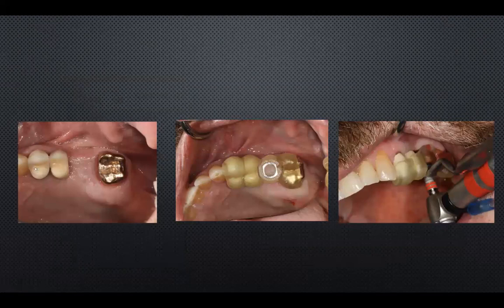And from here, you move to surgery, you place your guide, and you make sure it is stable. This metal sleeve, you attach it to your guide, and it depends on whether you want to go fully guided or half guided. The diameter of the sleeve changes.